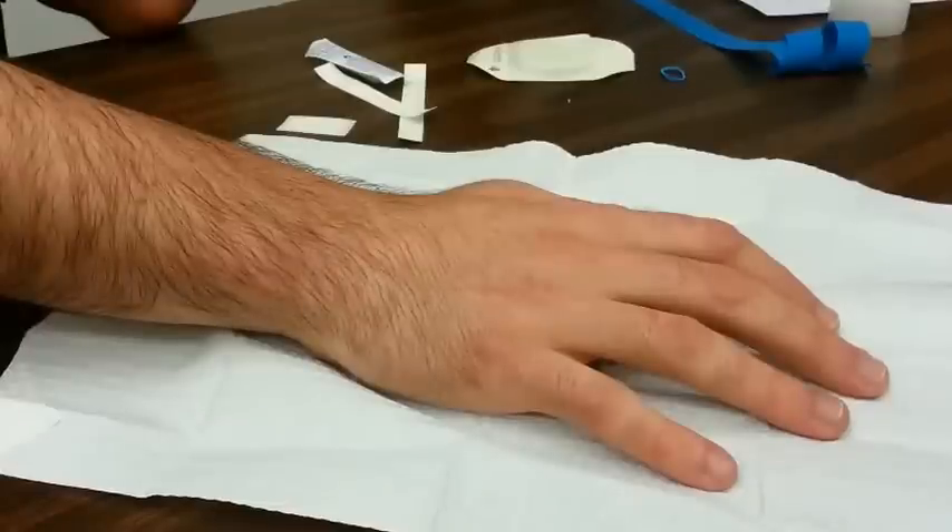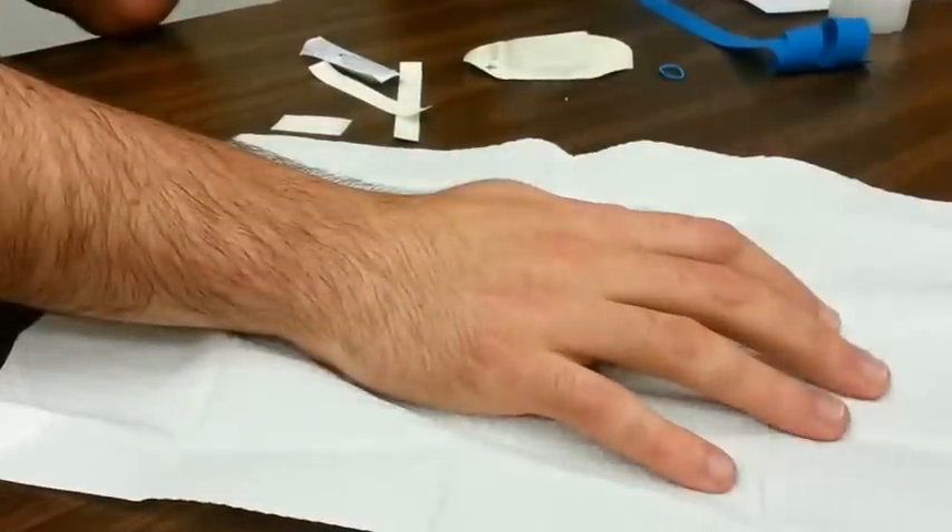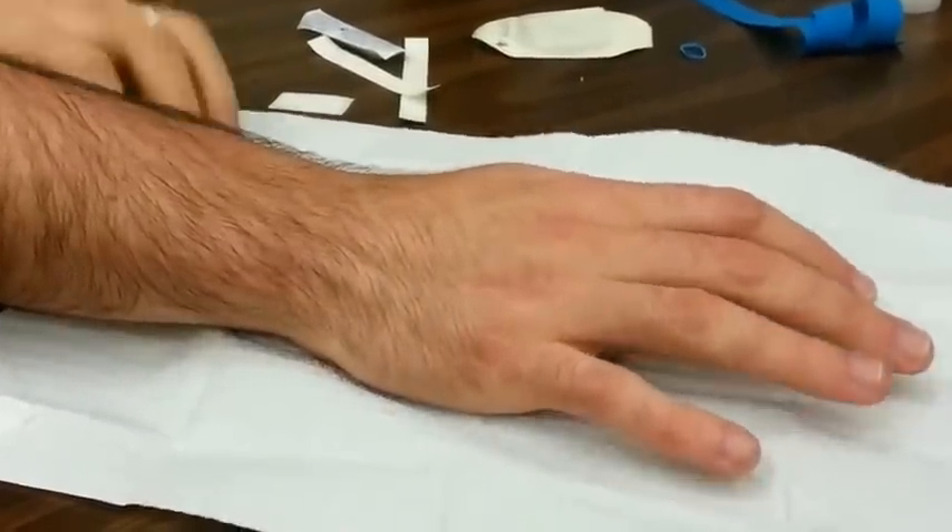To begin, you'll want to find a suitable vein. There are numerous veins that can be poked, but the most common veins are located on the upper extremity, mainly the antecubital fossa and the dorsum of the hand.